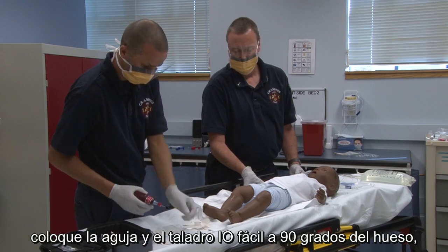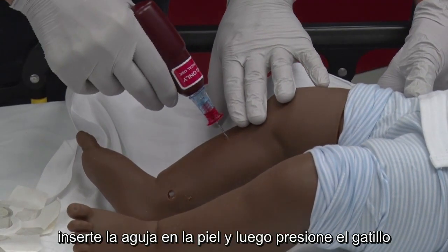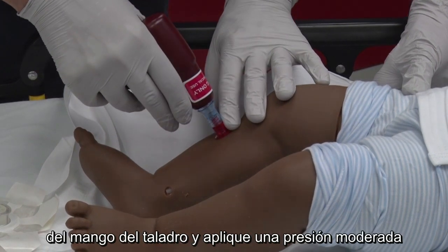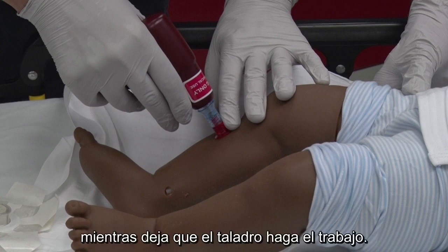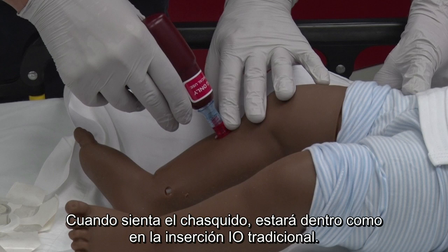Position the needle and Easy IO drill at 90 degrees to the bone. Insert the needle into the skin, then press the trigger on the drill handle and apply moderate pressure, while letting the drill do the work for you. When you feel the pop, you are in.